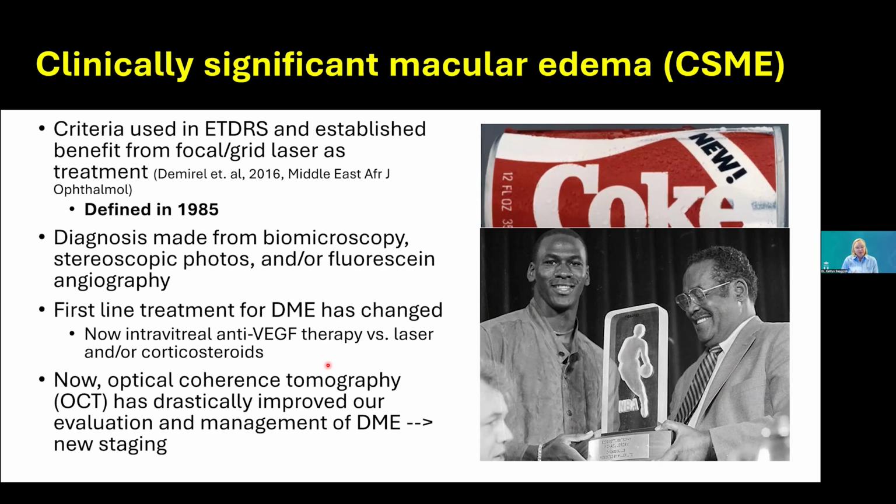And when a lot of the anti-VEGF clinical trials for diabetic macular edema were done, OCT and the thickness on OCT was really one of those primary endpoints. And so retina specialists right away started adopting using OCT to manage these patients. We started using it in order to monitor our patients and refer our patients when they needed to be referred. And it allowed us to pick up macular edema much more, it was much more sensitive than our clinical examination or even fundus photography, since we're getting that cross-sectional high resolution image.